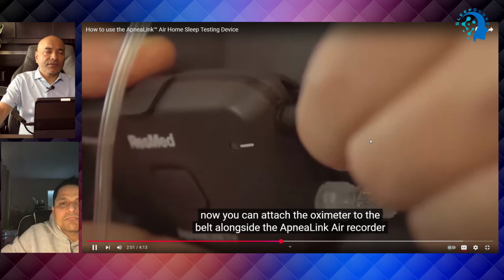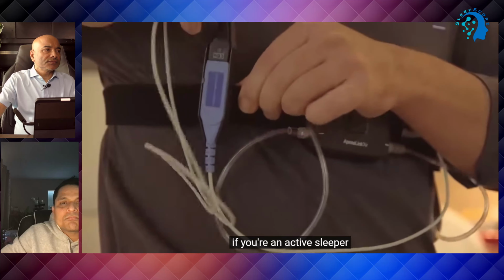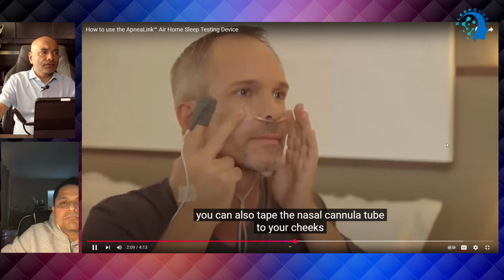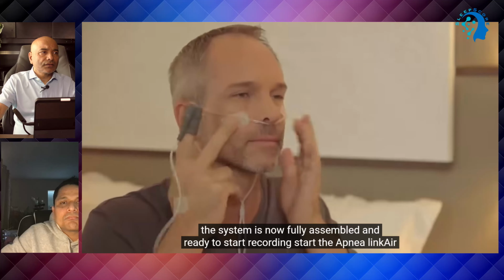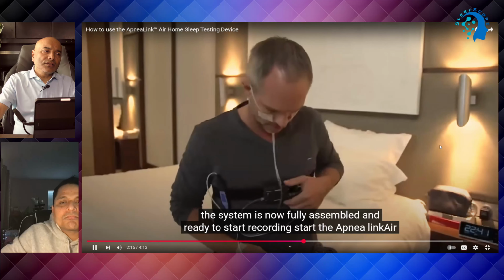Now, you can attach the oximeter to the belt alongside the Apnea Link Air recorder. If you're an active sleeper, you can also tape the nasal cannula tube to your cheeks. The system is now fully assembled and ready to start recording.